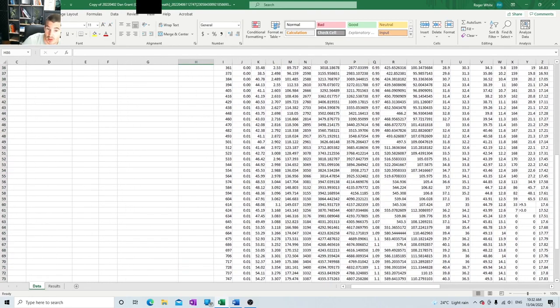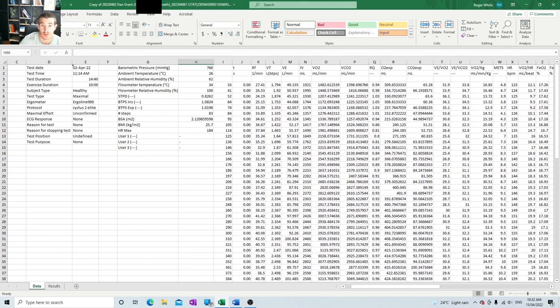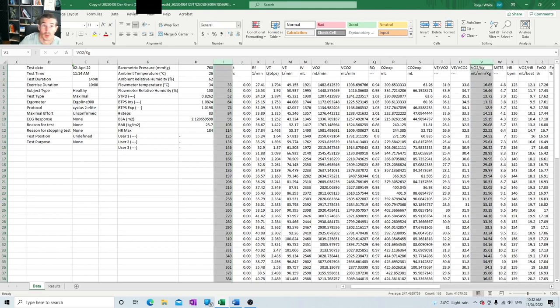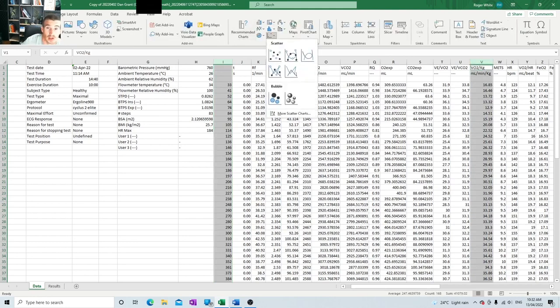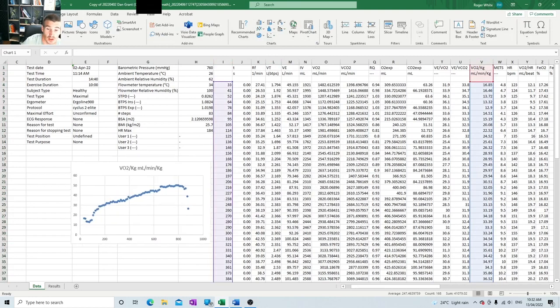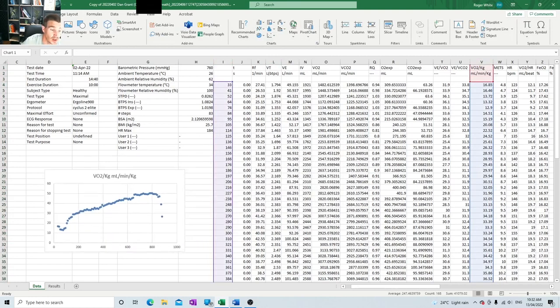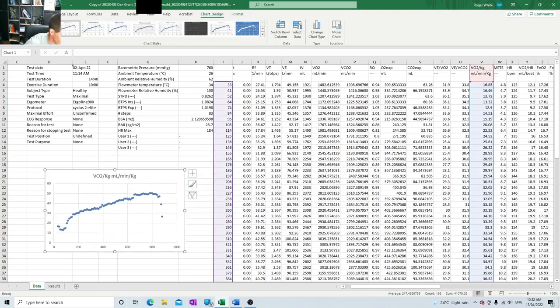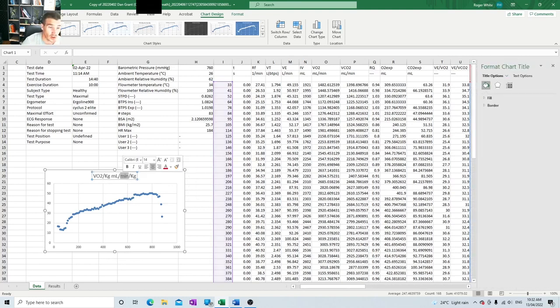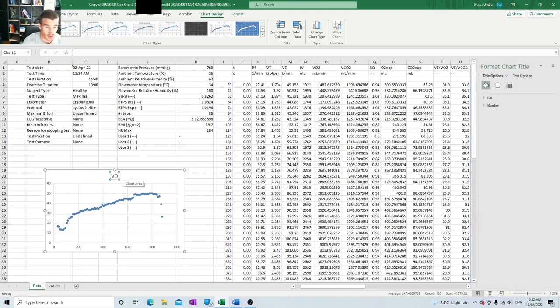So then to compare this against VO2 max, we copy that, and then we copy this line. We go insert, charts, scatter. So this is going to give us a graph like so. Now this graph measures their oxygen consumption relative to their body weight in a line up until VO2 max. And this is plotted against time, but we need to include all of the axes so the client can understand what this is. So we're just going to title it first. So the graph is going to be called VO2 max.